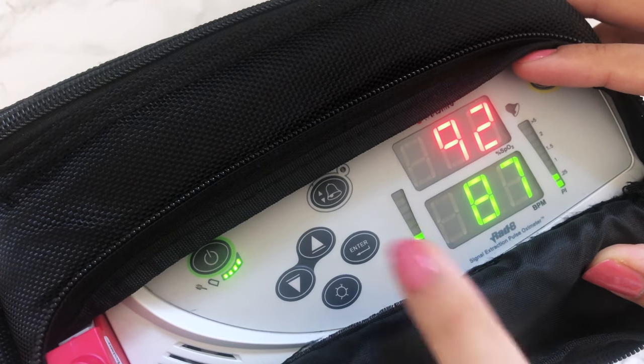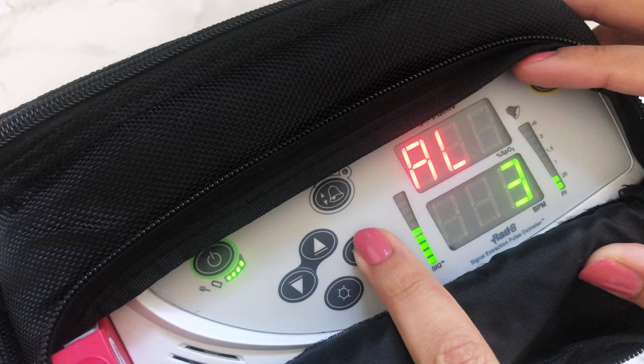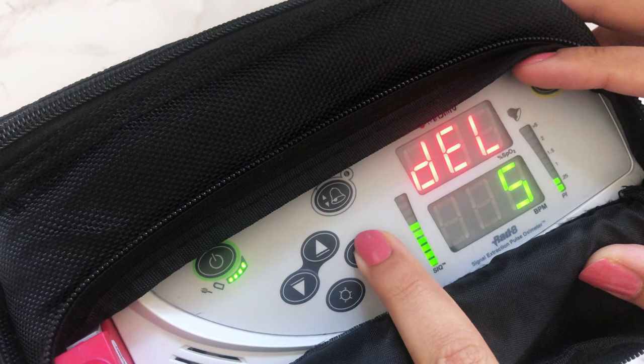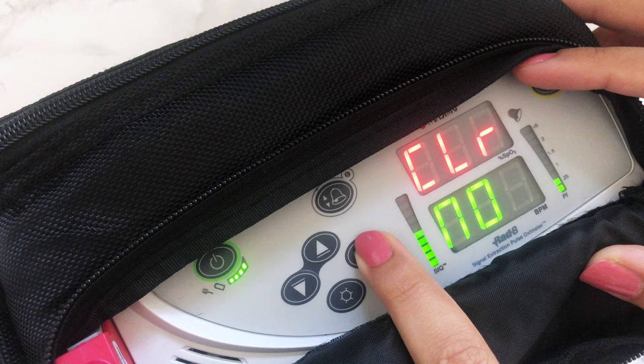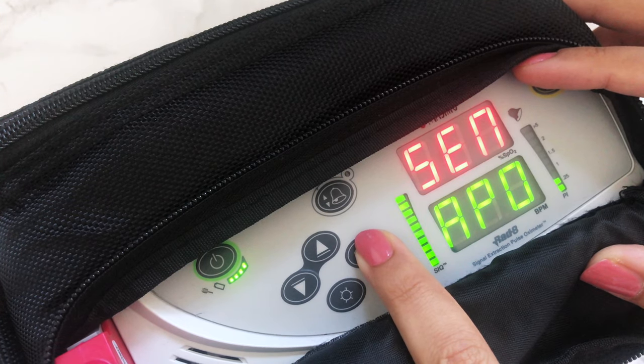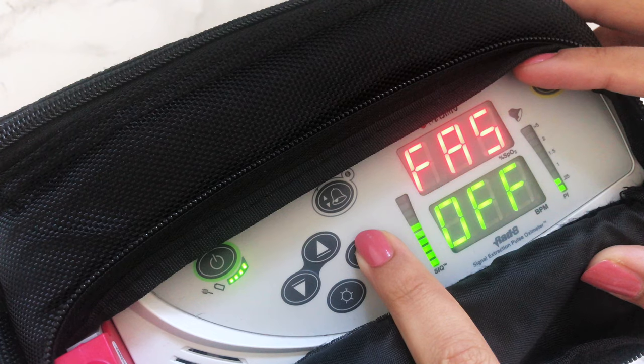Pressing the enter button opens up different setups. Alarm volume is set to level 3, alarm silence is 120 seconds, alarm delay is 5 seconds, clear trend is no, button volume is off, sensitivity is set to APOD, and fast sat is set to off.